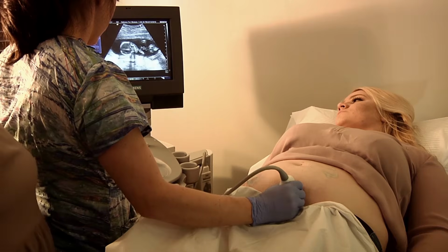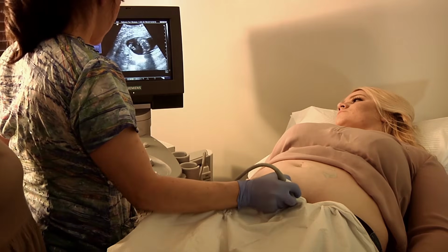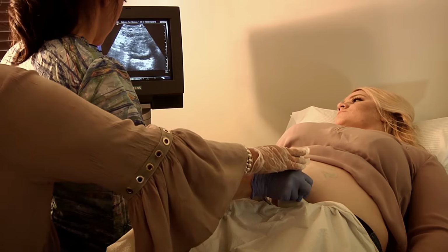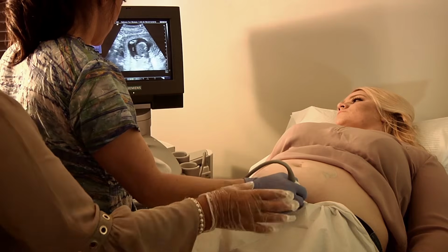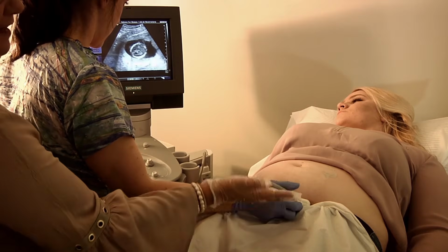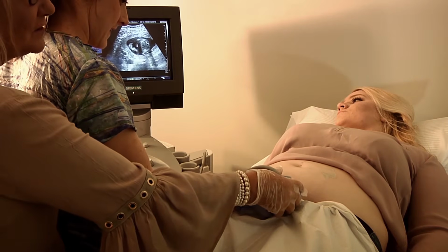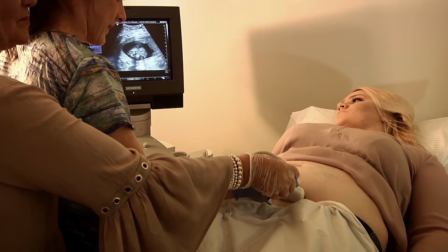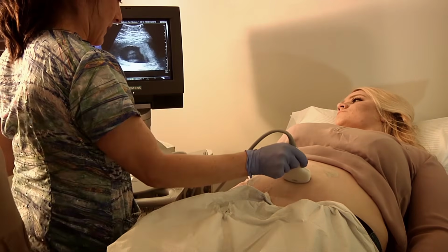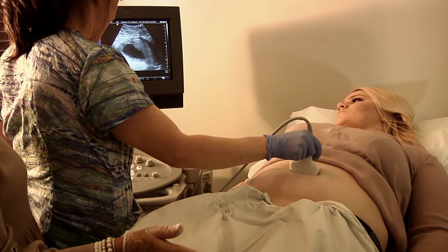Now we go transverse, counterclockwise, starting inferior, and then coming up. And notice as she rides up the belly, she's going to see how she's angling. Now you don't want to do that, not this far along. You're going to use the amniotic fluid. You're going to stay perpendicular and ride up, going perpendicular up the abdomen, all the way out.